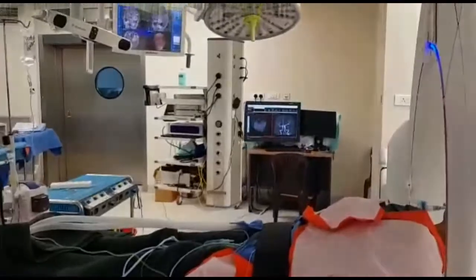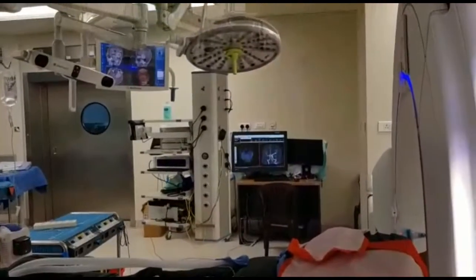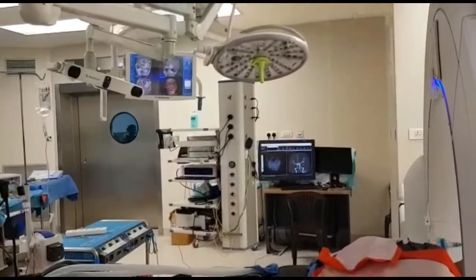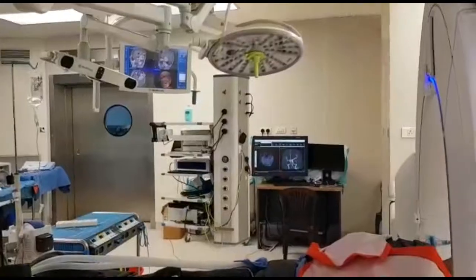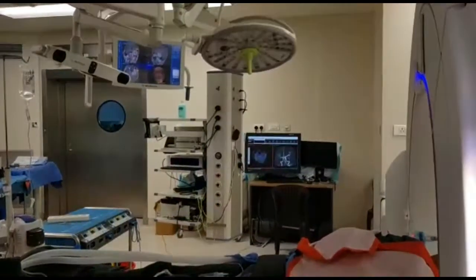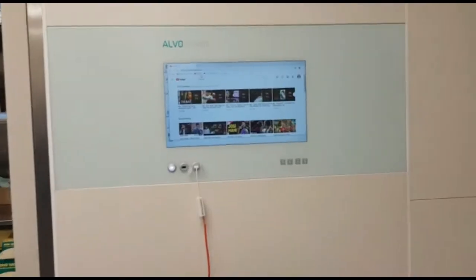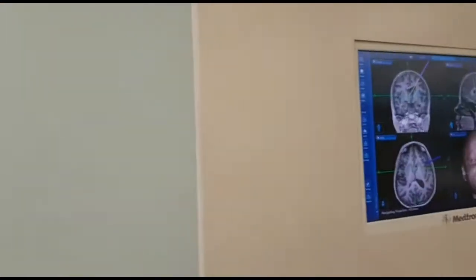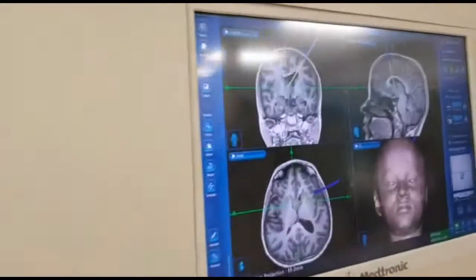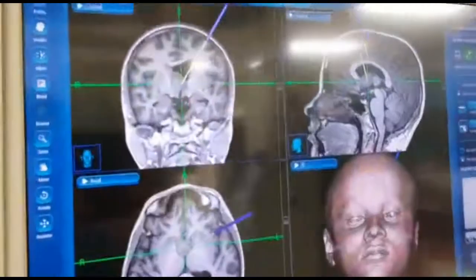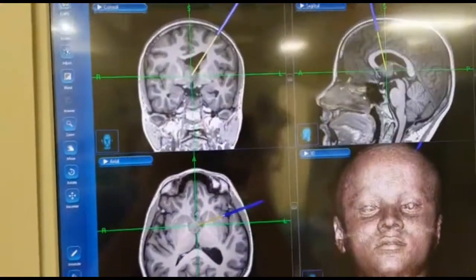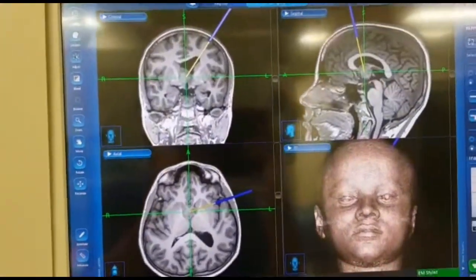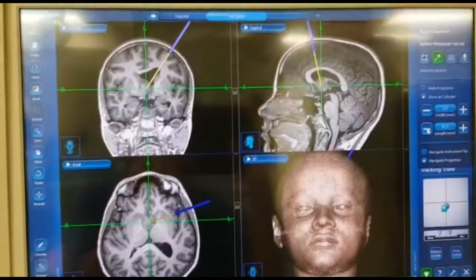That's the IDA system and the roof-mounted I7 navigation — it's a PACS system seen there. We are using electromagnetic navigation for this small child with a third ventricular tumor.